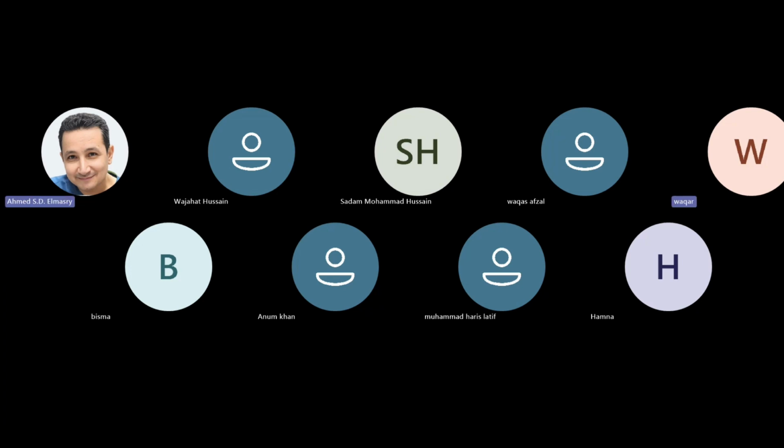But when we talk about the IABP, the diastolic pressures are called the augmented pressures. These are even more than the systolic pressures, and they are for the coronary filling. This is the whole idea about the intra-aortic balloon.